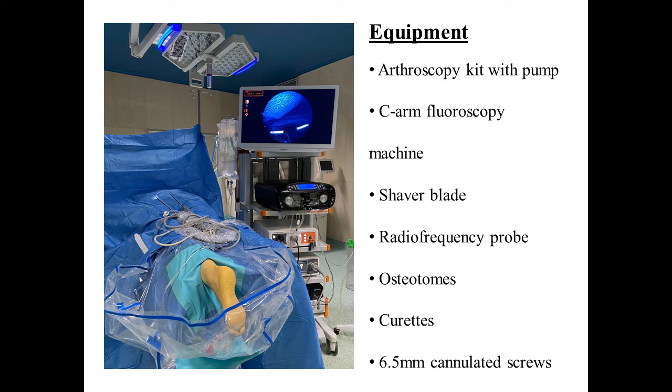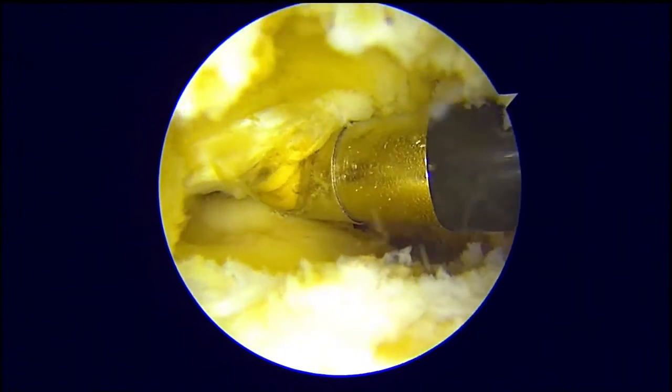We use an arthroscopic kit with pump, shaver blade, radiofrequency probe, osteotomes, curettes, and large diameter cannulated screws for subtalar fixation.